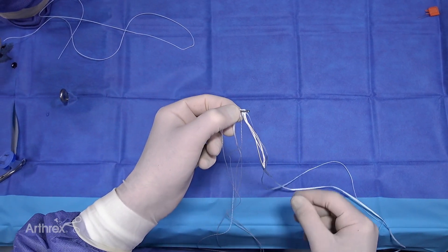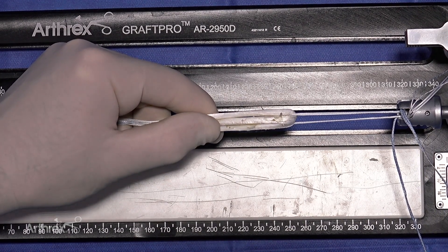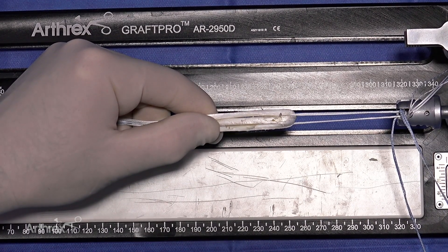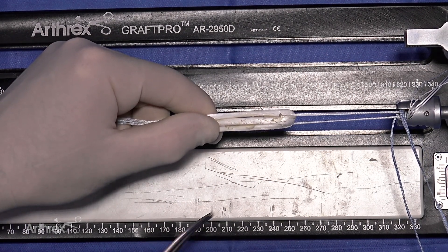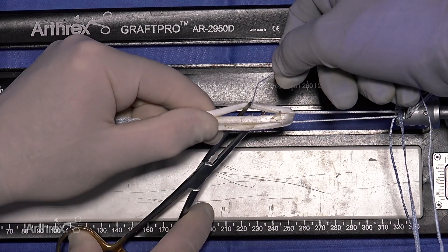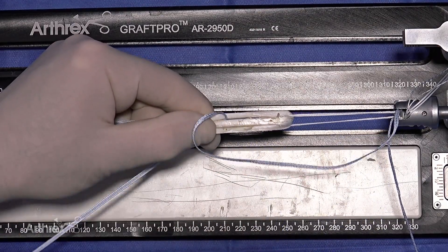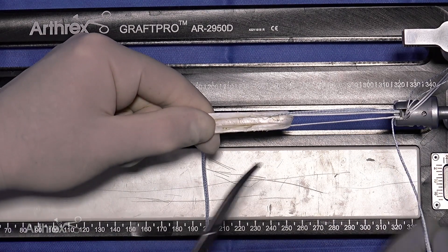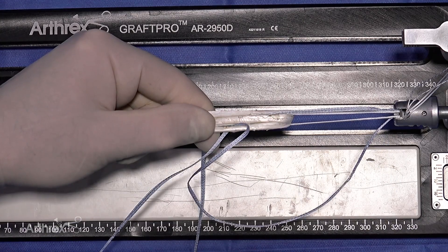Now we prepare the graft. We've created our four-stranded graft-linked construct, and before suturing, we want to go through this important step of how to pass the tapes. When done this way, the tapes will be inside the construct and will not be visible at the end of the procedure when the graft is in place in the knee. We have four strands of the graft. Take a hemostat and come between the outer strand on one side and the inner construct, and pass one end of the tape through the outer limb of the tendon from the central part of the tendon to the other side.